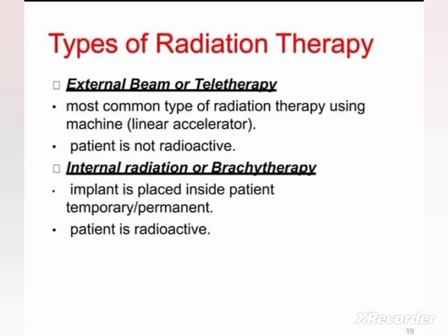Types of radiation therapy include external beam radiation therapy or teletherapy, and internal radiation therapy or brachytherapy. External beam radiation is the most common type of radiation therapy.